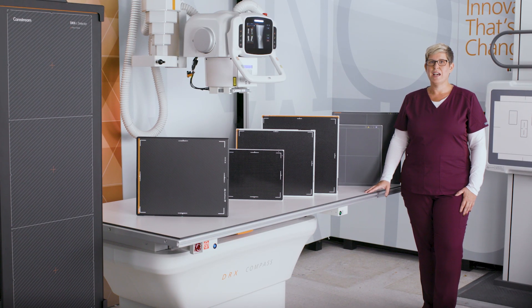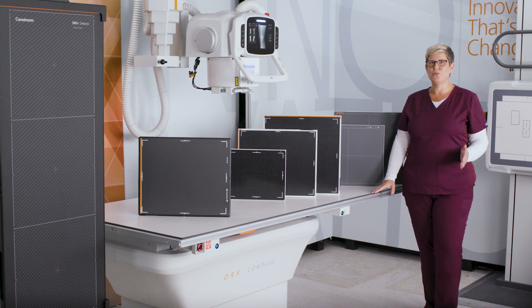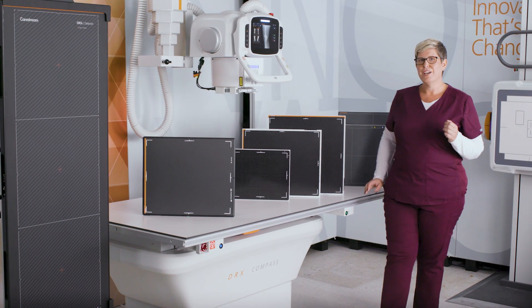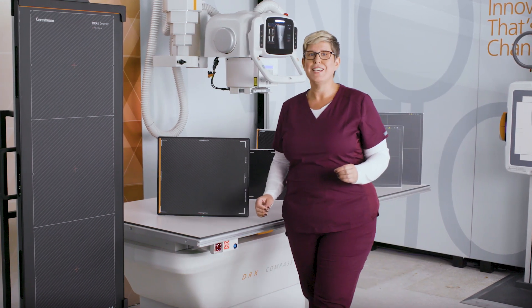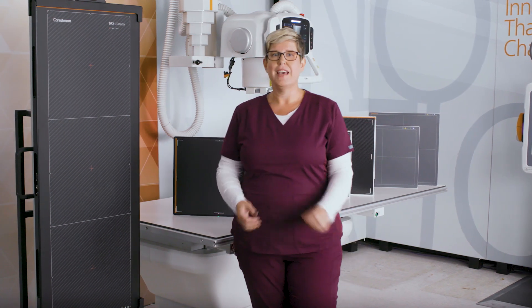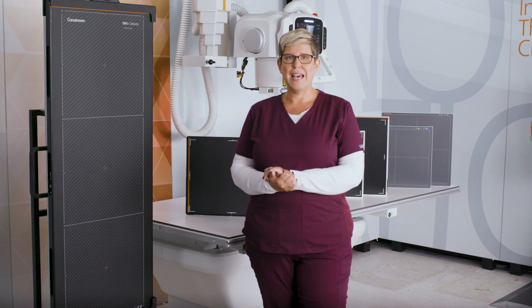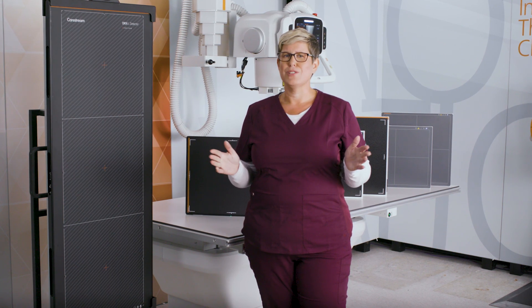Hi, I'm Jen Twaits, an applications engineer here at CareStream, and today I'm going to show you the DR detector family. Over a decade ago, CareStream was the first to introduce a cassette-sized wireless DR detector for x-ray imaging. Ever since, we have continued setting new standards in efficiency, reliability, and affordability as our portfolio of DR detectors has grown.